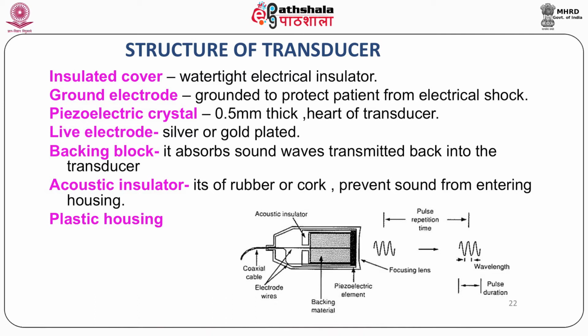The inside electrode is against the thick backing layer that absorbs the sound waves transmitted back into the transducer. An acoustic insulator of rubber or cork prevents the sound from passing into the housing. The housing is usually a strong plastic.